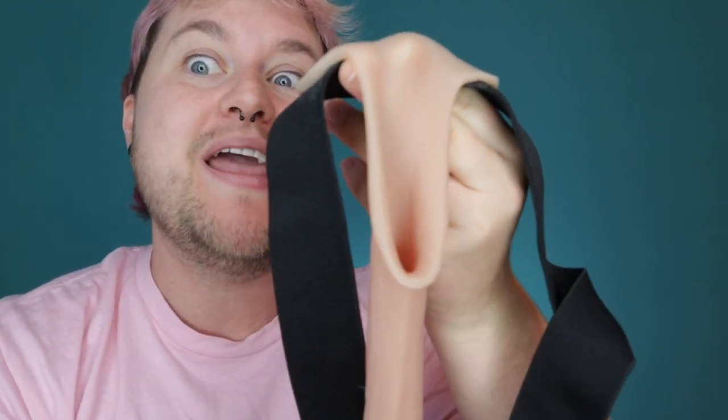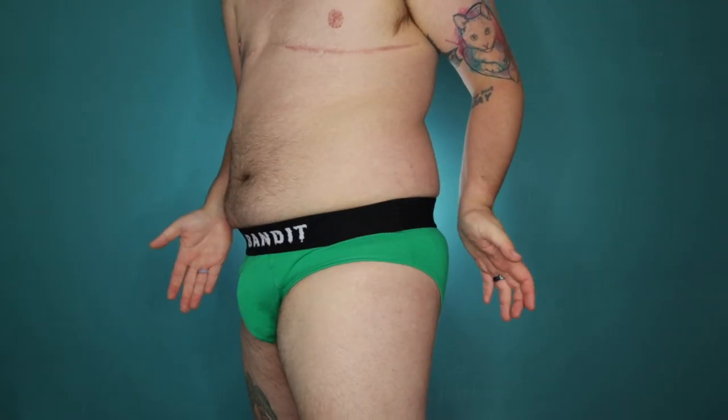I get a lot of comments from people asking about packers without balls, or they cut the balls off their packers — some people just don't like it, makes it more bulgy. So I actually put this on, put underwear over it, and I was shocked. It is a beautiful bulge, so even though I haven't had metoidioplasty and my peen isn't actually in there, it still leaves a really good bulge. Let me show you that now. As you can see, it just does a really good bulge.